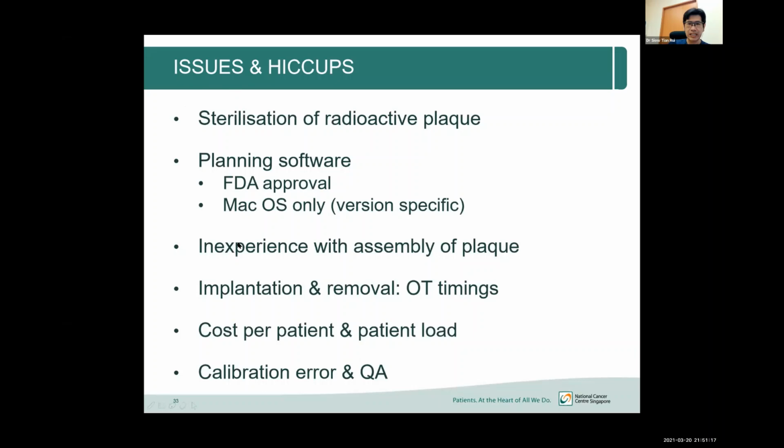One of the things I want to mention was that when we assembled the first plug, we dropped one of the seeds on the floor, the 4mm seed. That evening, we had one physicist, one ophthalmologist, and one radiation oncologist crawling on the floor with the Geiger counter looking for the missing seed. So that was one of the early problems.